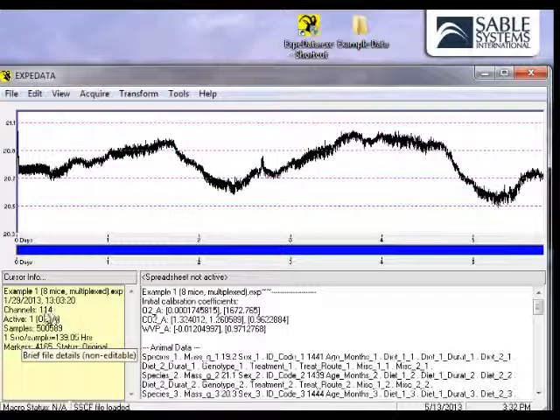It also shows you that there are a large number of individual channels — 114 in this case — each of which corresponds to a separate data source. All are recorded at a one-second interval. The one on screen right now is the output of the oxygen analyzer, which changes as the water vapor pressure in the air changes.